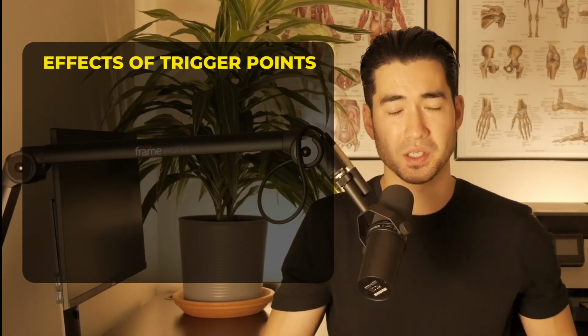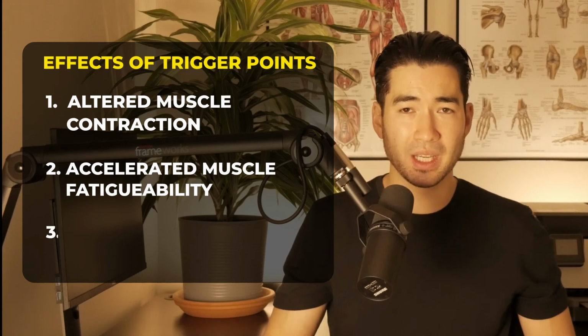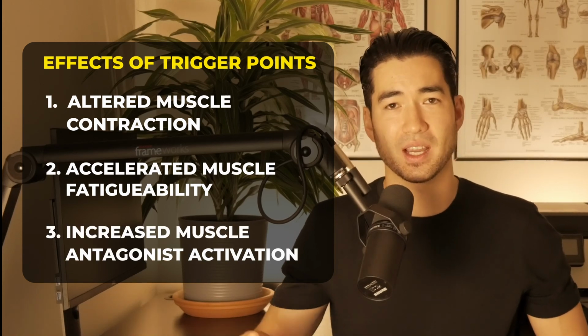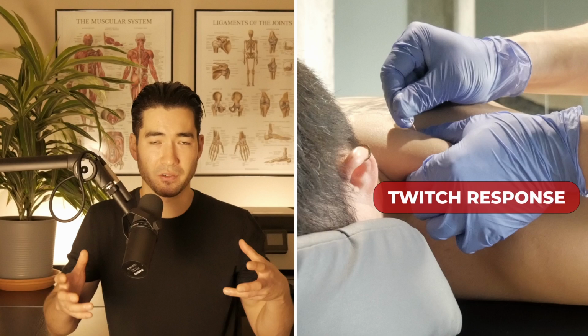Trigger points can also contribute to functional impairments, such as altered muscle contraction, accelerated muscle fatigability, and increased muscle antagonist activation. We'll get into what exactly that means and how that affects our function later in the video. But first, I want to explain the physiology, or what exactly is happening within our body during the dry needling process. When a trigger point is hit with the dry needle, a twitch response occurs, which is a reflexive contraction of the muscle, which is supposedly mediated from a reflex from the spinal cord.